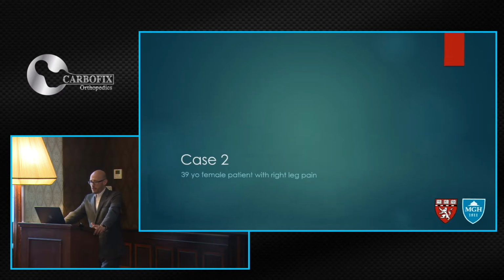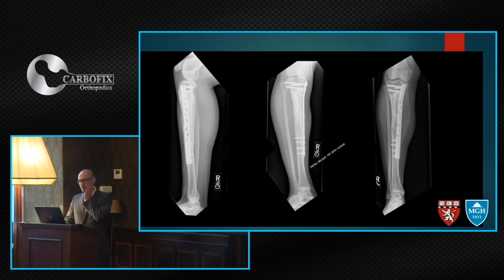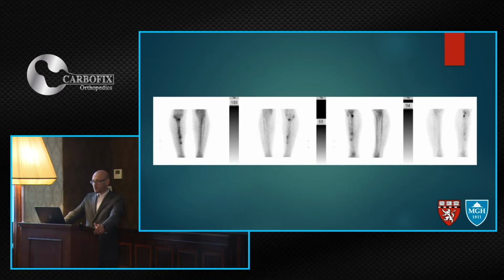I have another patient of his. He loved allografts, so this is an intercalary resection for an osteosarcoma as well. The patient was having pain. There was some loosening of the hardware, but not really evident on x-rays, but clinically that's what it seemed to be. I got a bone scan, and it shows some areas of activity, but the patient didn't have any markers of infection, and her blood work was normal. So I decided to take her for revision of this.